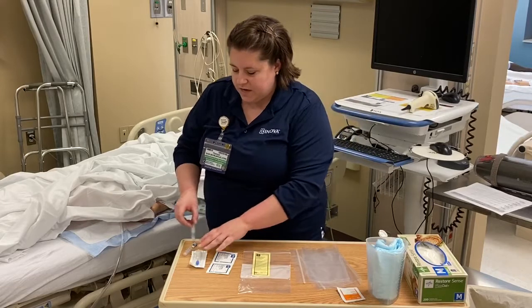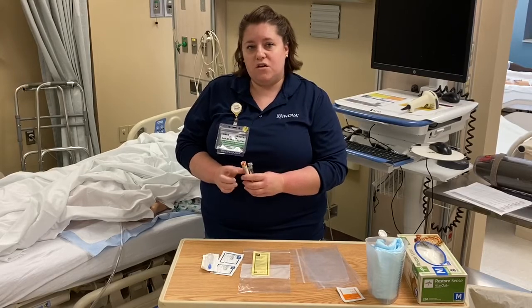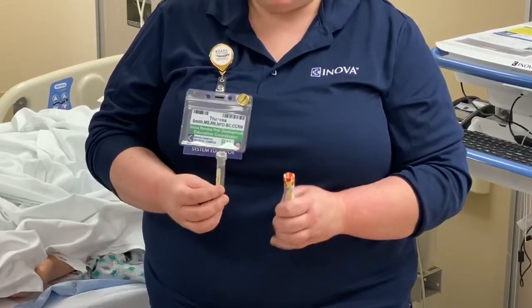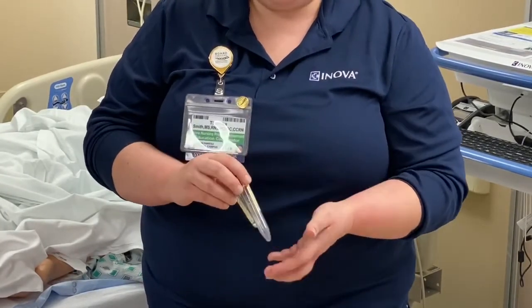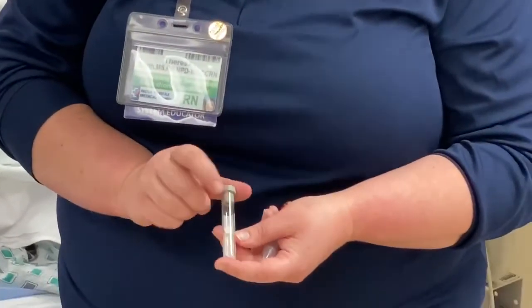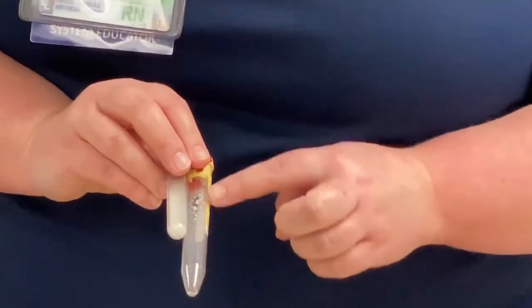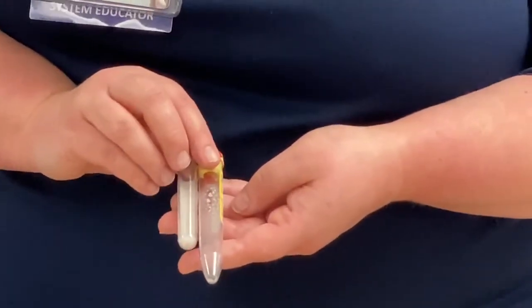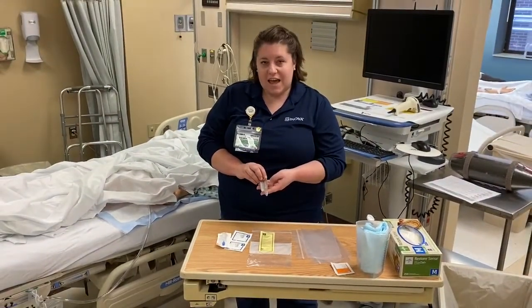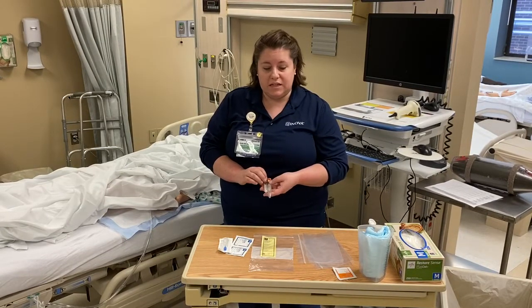So I have my tubes ready to go right here. And I need to arrange these in the order of the draw. So for collecting urine, I'm always going to collect the gray tube first. The reason for this is that there are different additives in my tubing. If you look really close to the gray tube, you can see there's some powder inside of it. And if you look close to this red and yellow tube, you can see there's some additive here on the side. And these additives allow my test to be run correctly and preserve the urine until it's time to run the test. These additives, if they get mixed incorrectly, can cause the test not to run accurately, so there's a certain order that I need to follow.